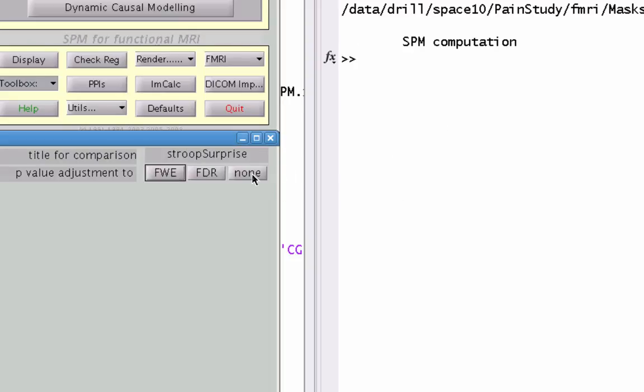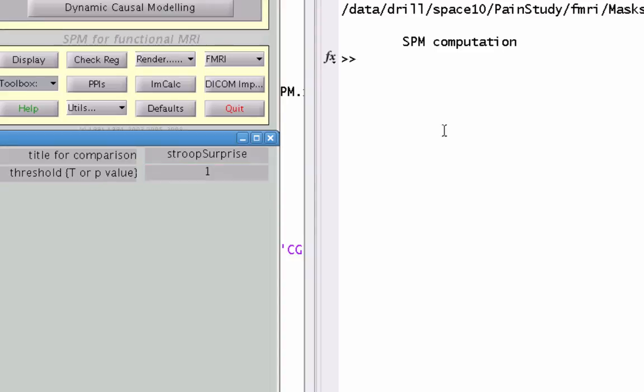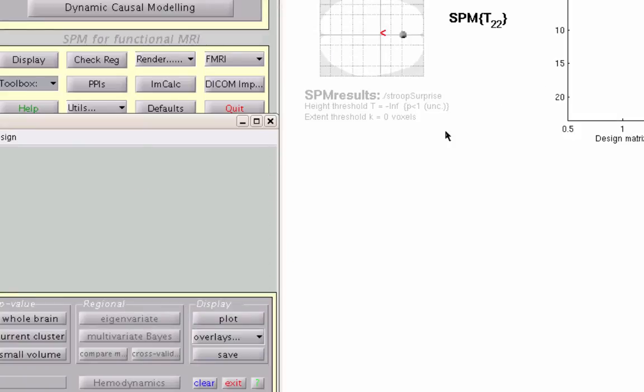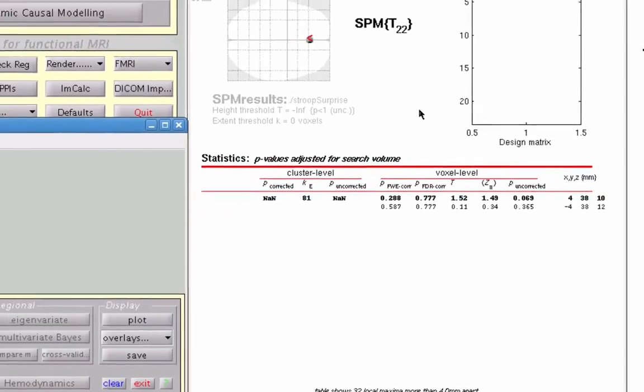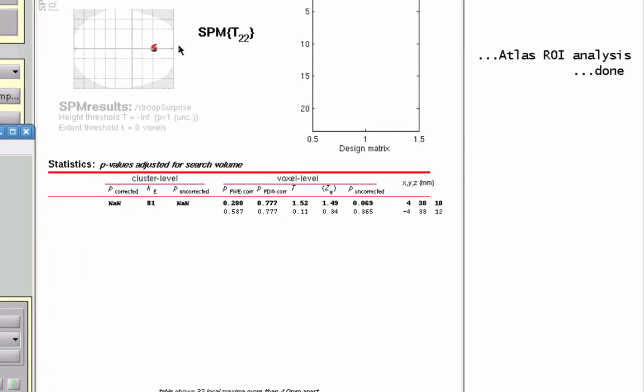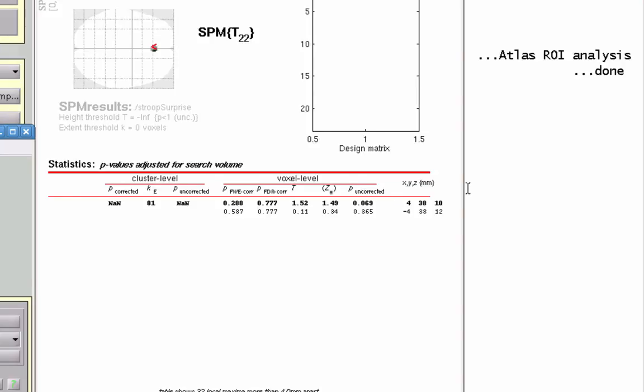The critical thing here is for the p-value adjustment, we just hit 1 and then a 0 for extent threshold. Now what this is going to do is it's basically going to light up or make active every voxel in that ROI.